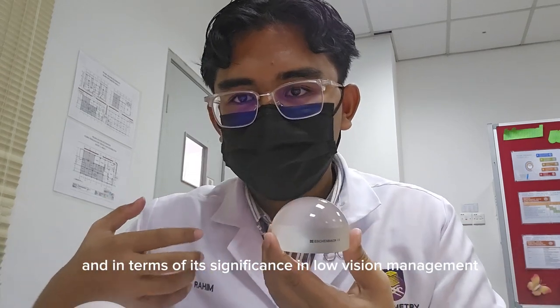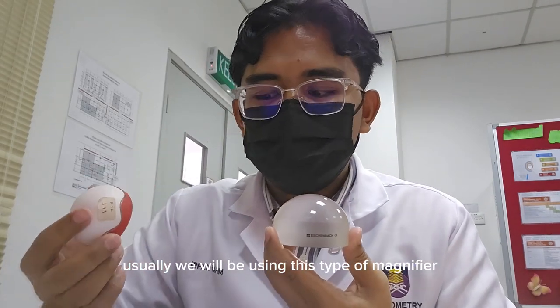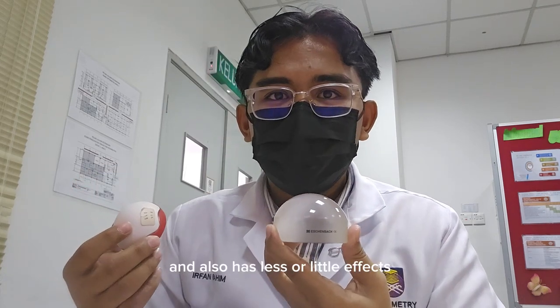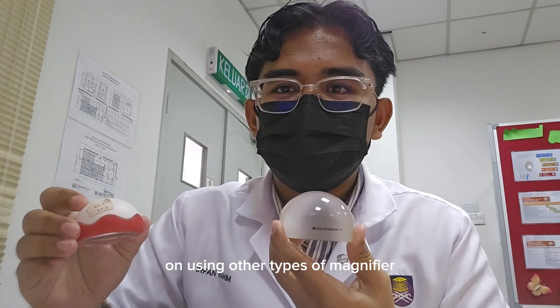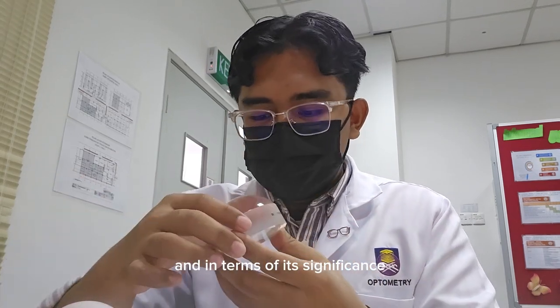In terms of its significance in low vision management, we will usually be using this type of magnifier for patients that have myopia, and also who have little effect from using other types of magnifier.